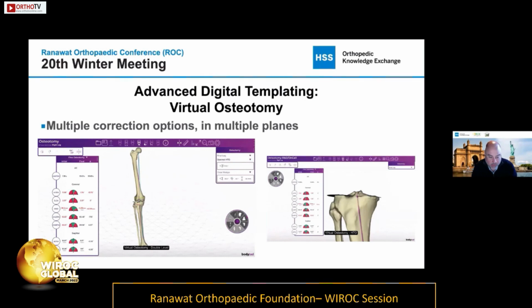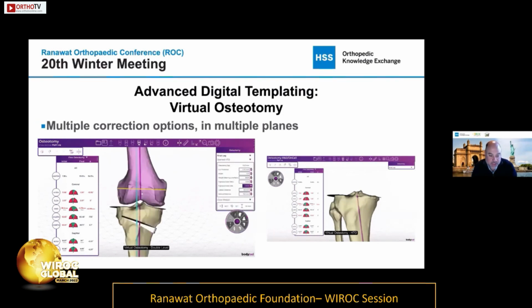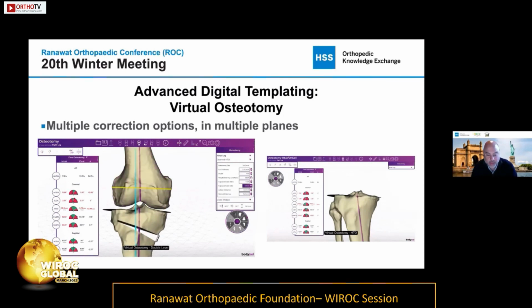And the thing with improved technology, you have to really know where you want to go and realize also that with your traditional analysis using just x-rays, there is a little bit of a learning curve to understand how CT technology can be slightly different in terms of how you define your goal of your correction. But this is an example of doing a double level osteotomy and how you can adjust your Fujisawa's point to where you really want to put it.